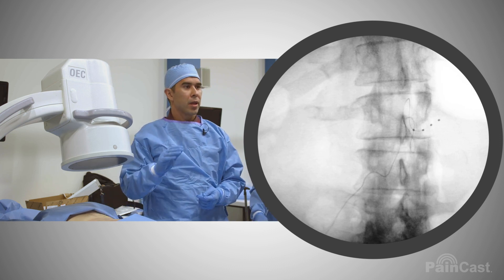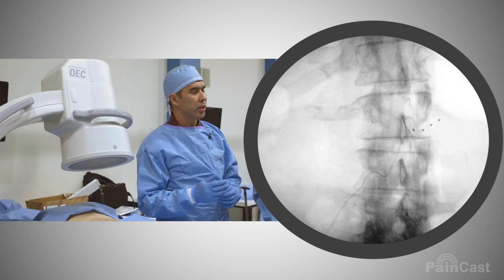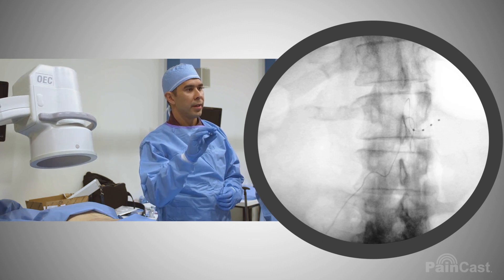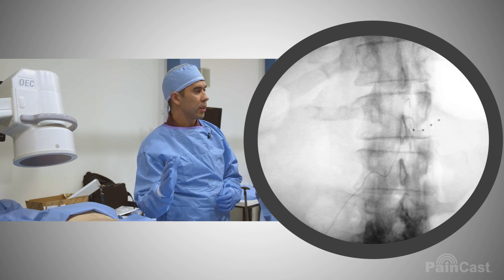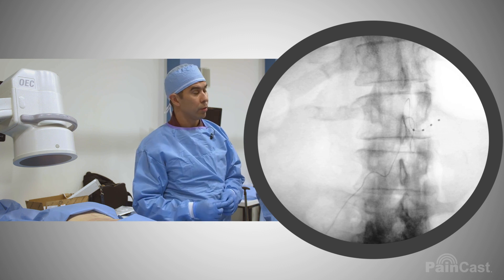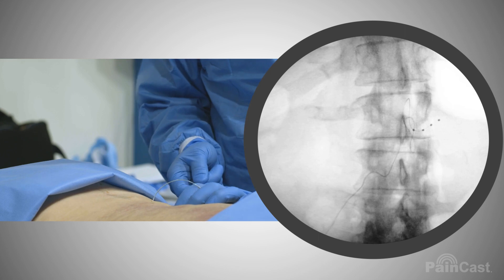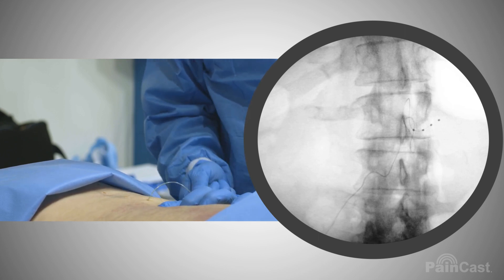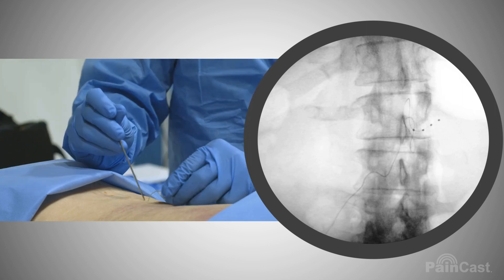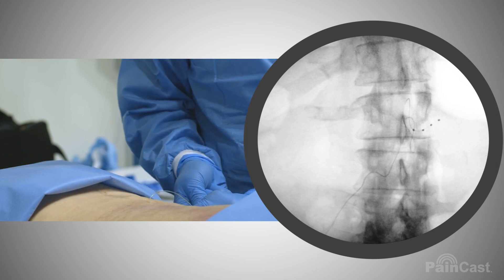So why do a loop? So it doesn't migrate? It's called the S loop. The reason for that is you're creating this loop, and in the lower lumbar, essentially, you don't have to anchor the lead. So you create this loop — you could actually make a little more of a loop if you wanted — and then you can use a tunneled epidural technique.